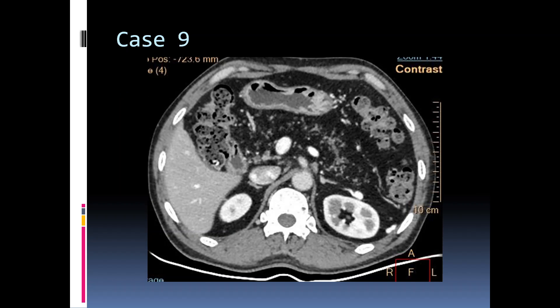Contrast-enhanced CT abdomen at the level of the pancreas shows that the entire pancreatic parenchyma is infiltrated with fat. So this is a case of pancreatic lipomatosis.